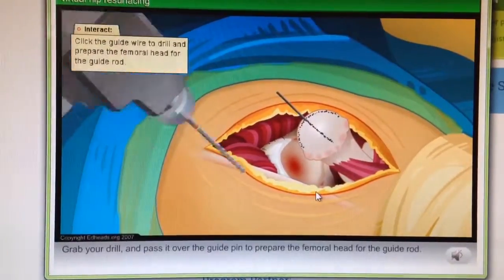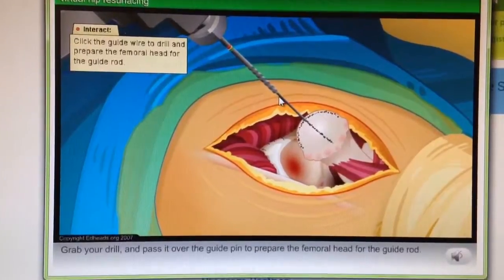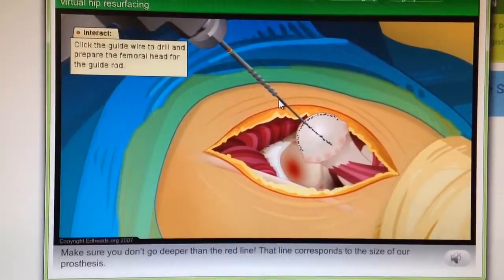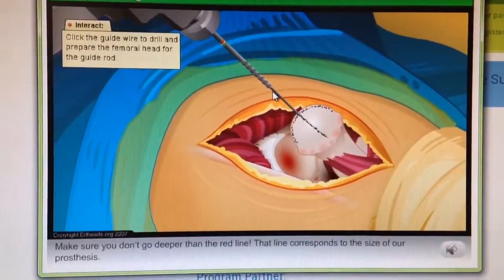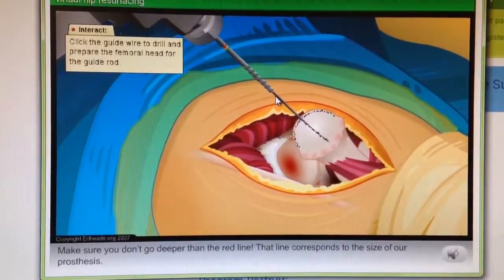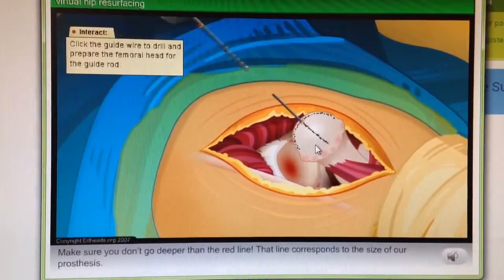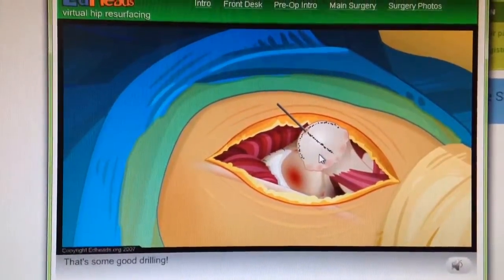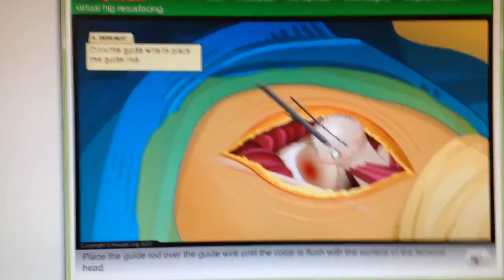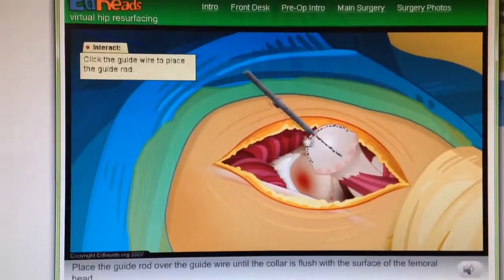Good job. Grab your drill and pass it over the guide wire to prepare the femoral head for the guide rod. Make sure you don't go deeper than the red line — that line corresponds to the size of our prosthesis. That's some good drilling. Place the guide rod over the guide wire until the collar is flush with the surface of the femoral head.